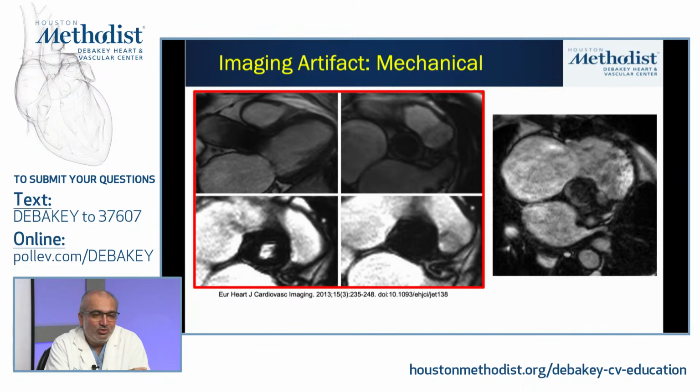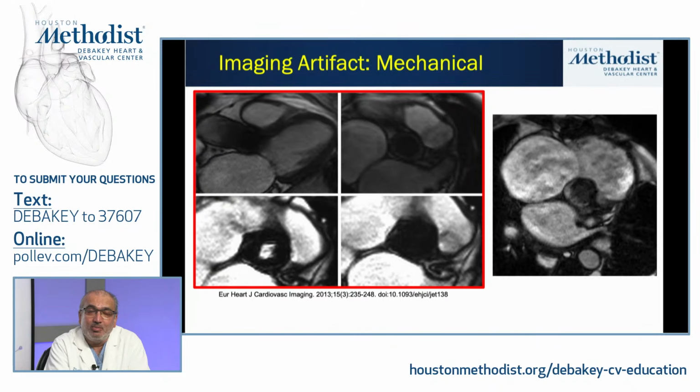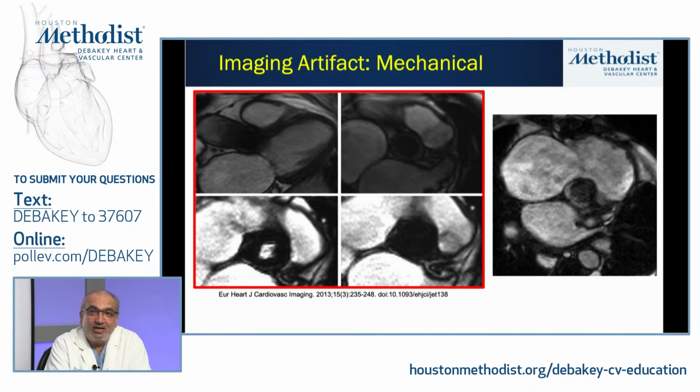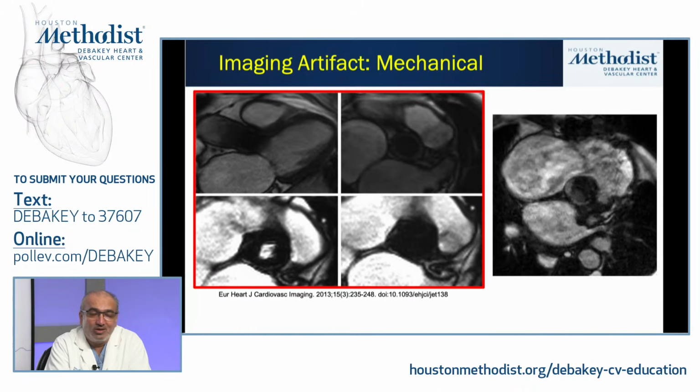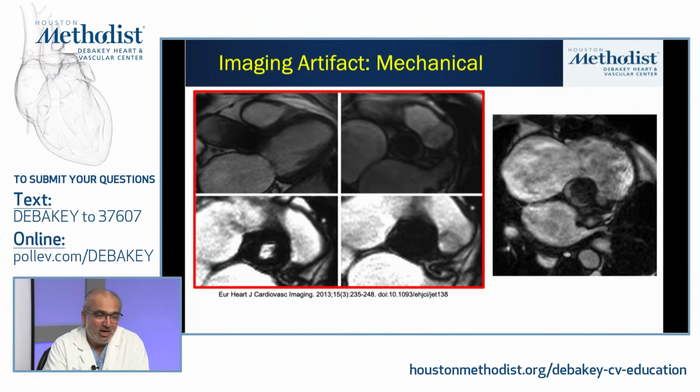So if you're trying to assess for stenosis, it can be quite challenging by MRI. And so as a result, my answer would be that if it's a mechanical valve and your question is about stenotic severity, MRI is probably not the best test to do that.